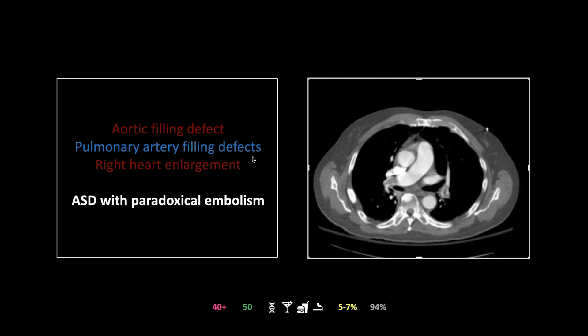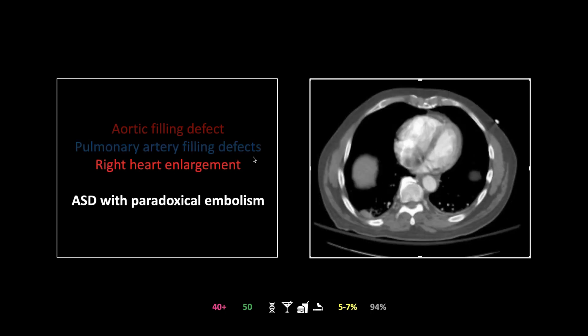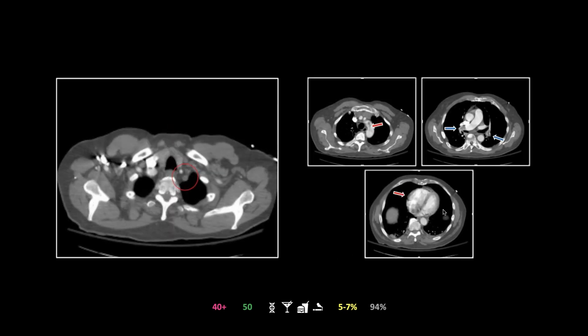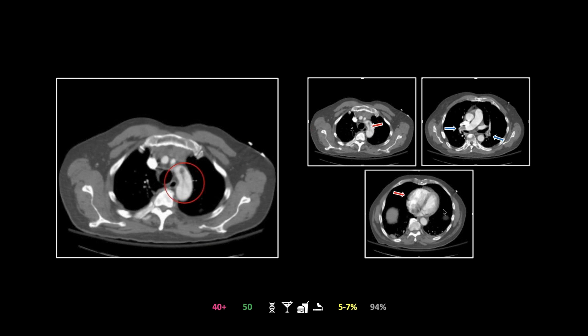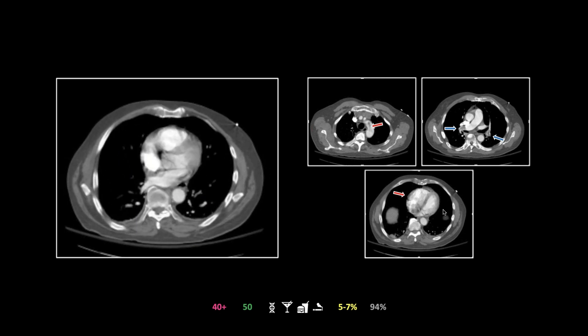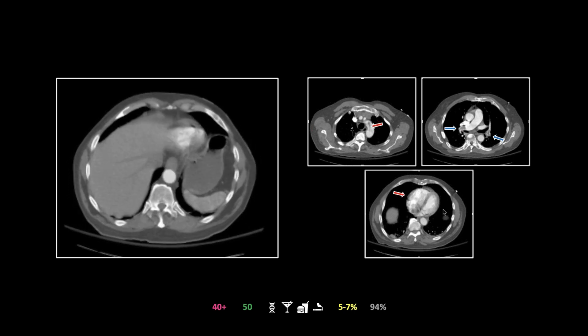These are the pulmonary emboli. Significant pulmonary embolism increased right-sided pressure and led to right-to-left shunting. The right side of the heart is large — that was one of the first things noted when opening the case, already showing chronic left-to-right shunting in this relatively younger patient. Here's that left subclavian leading to an aortic filling defect — obviously the complication you really don't want with an ASD. The enlarged right heart is apparent throughout.